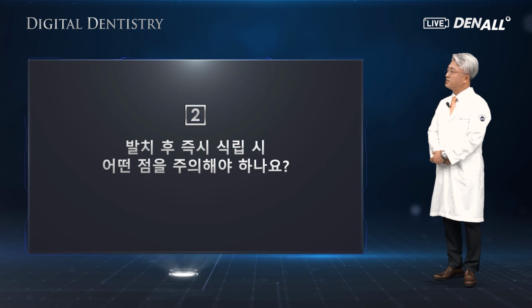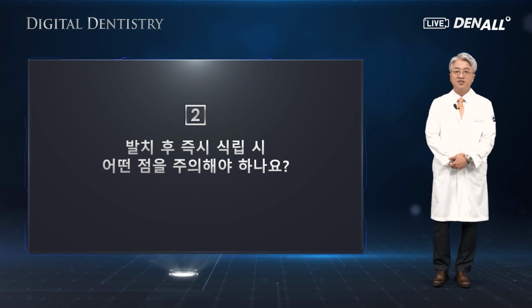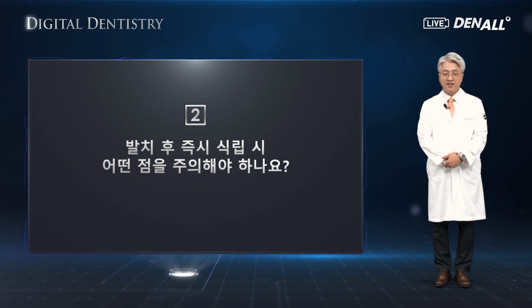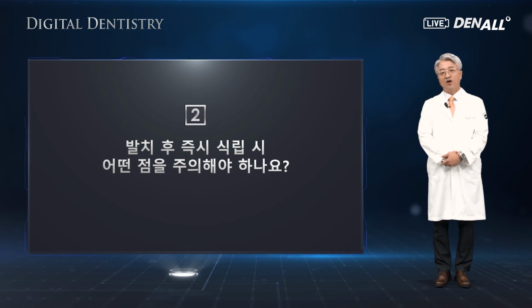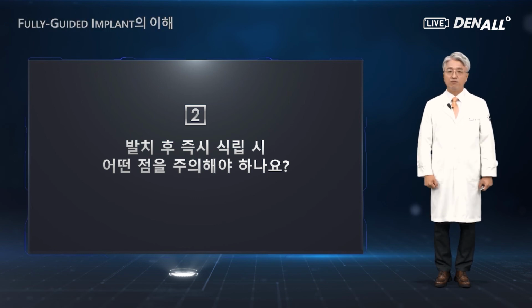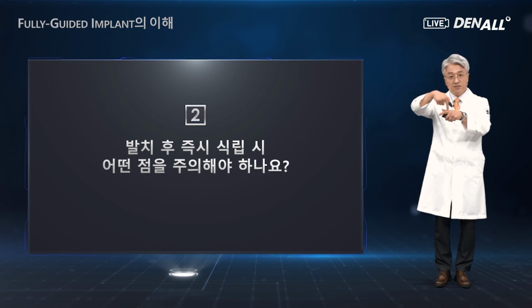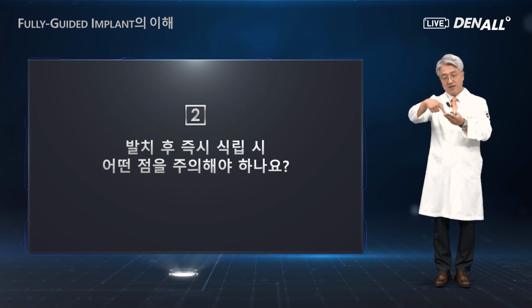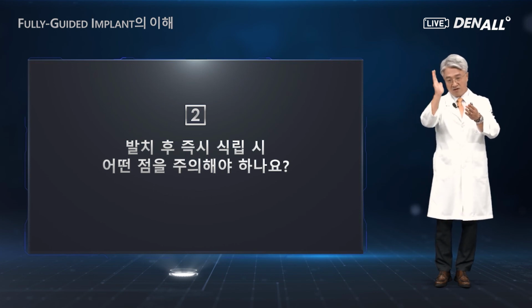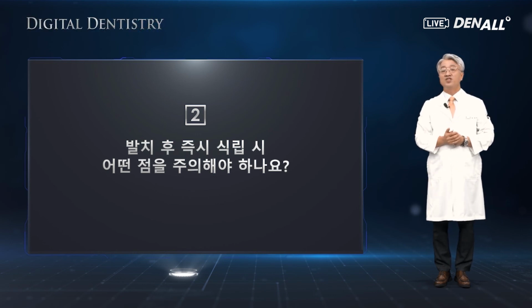Next, what should be the things we need to consider for immediate placement after extraction? This is one of the most challenging guided surgeries because there are irregular extraction sockets. We do the drilling through the guide, but depending on the shape, like a concave wall of the extraction socket, the drill can slip.